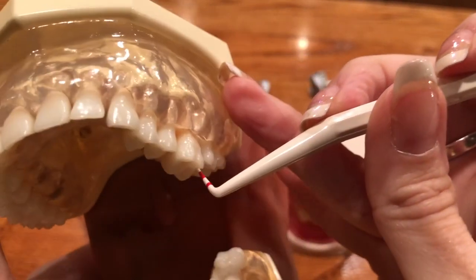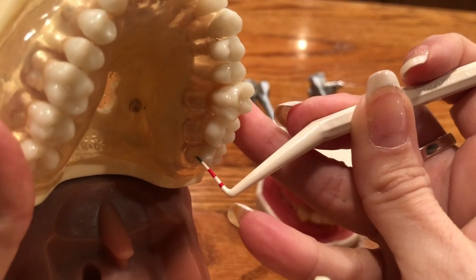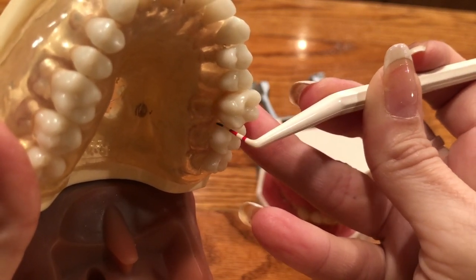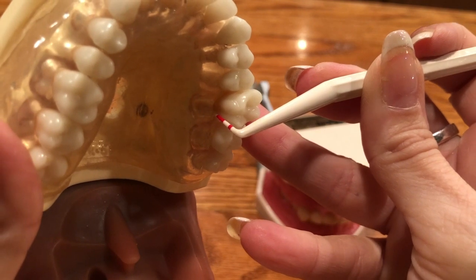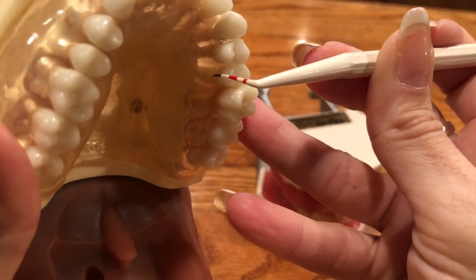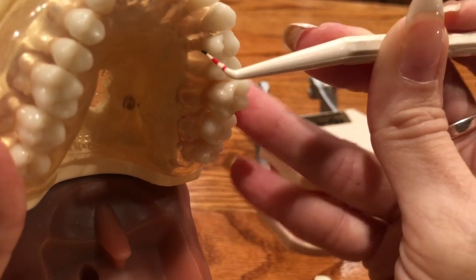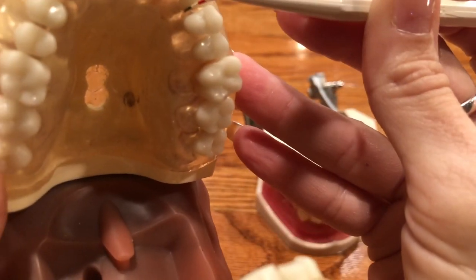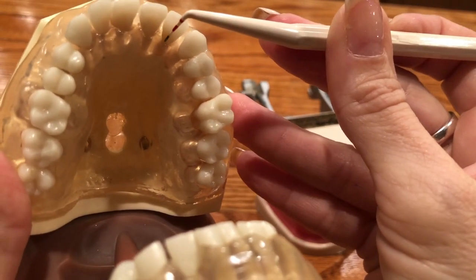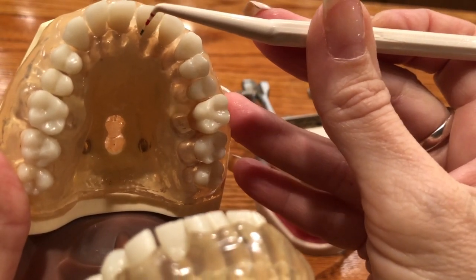Then your hygienist is going to come back around. 3, 3, 3, 3, 3, 3, 6, 6, 3, 2, 1, 2, 2, 1, 2, 2, 1, 1, 1, 1, 1, 1, 1.